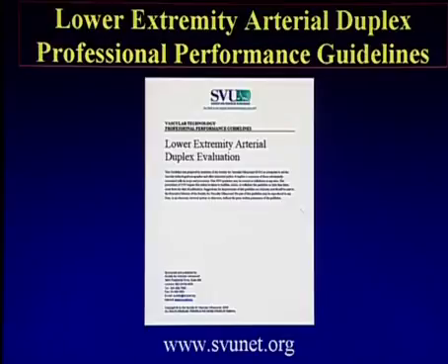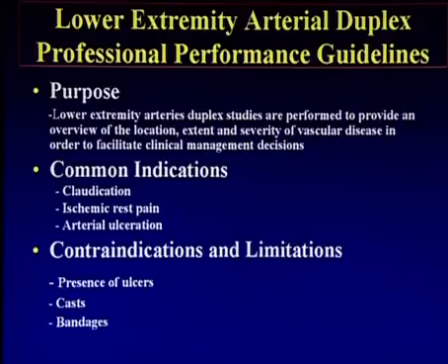These guidelines were prepared by members of the Society of Vascular Ultrasound as a template to aid vascular technologists and other interested parties. The first portion of the guideline is divided up into 3 sections: the purpose, common indications, and contraindications and limitations.